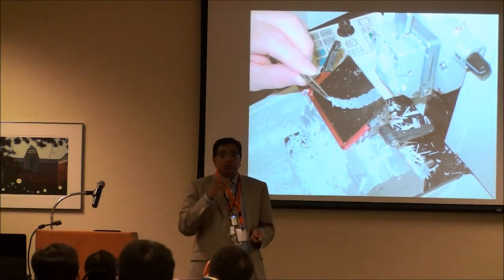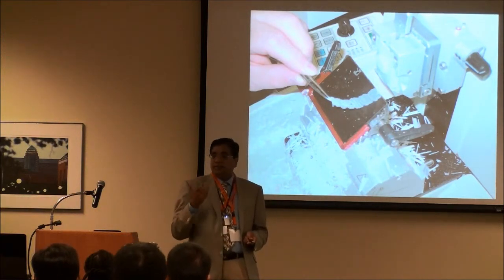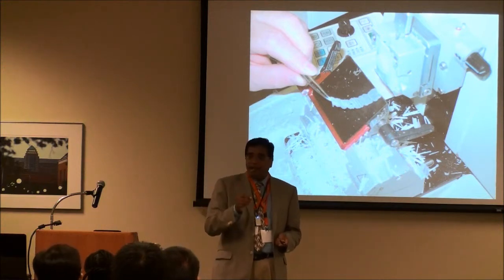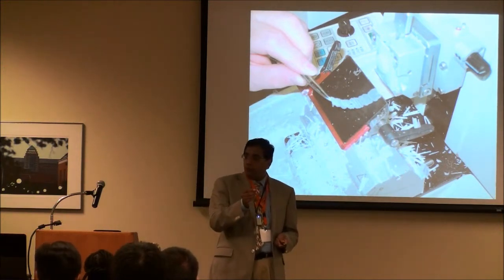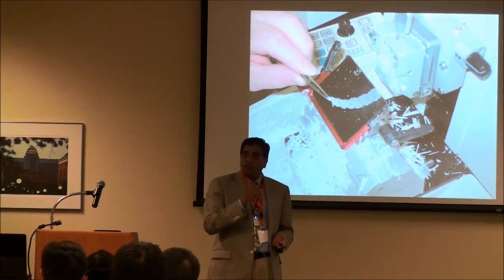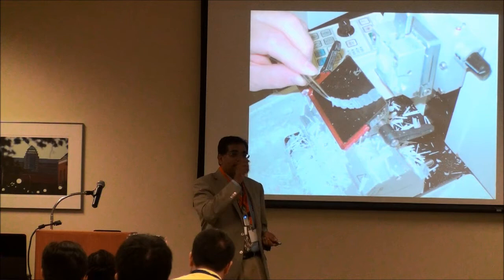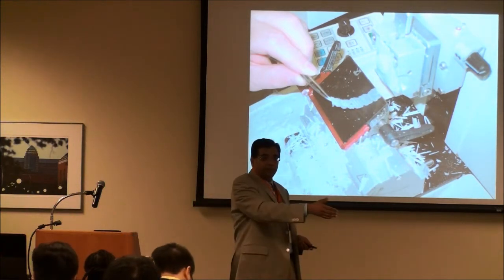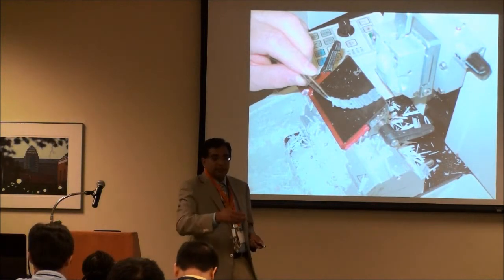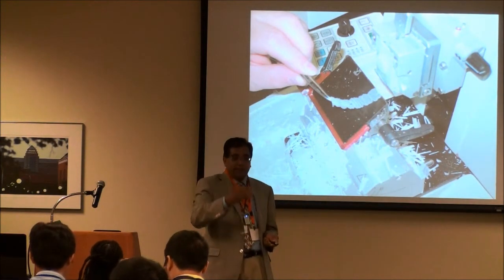We can do something called immunohistochemical stains, where we use antibodies to tag that epitope of protein and see if it is present or absent. If it is present, you can use a certain treatment. If it is absent, you use a different treatment. That immunohistochemical stains and special stains, antibody workup, comes later.